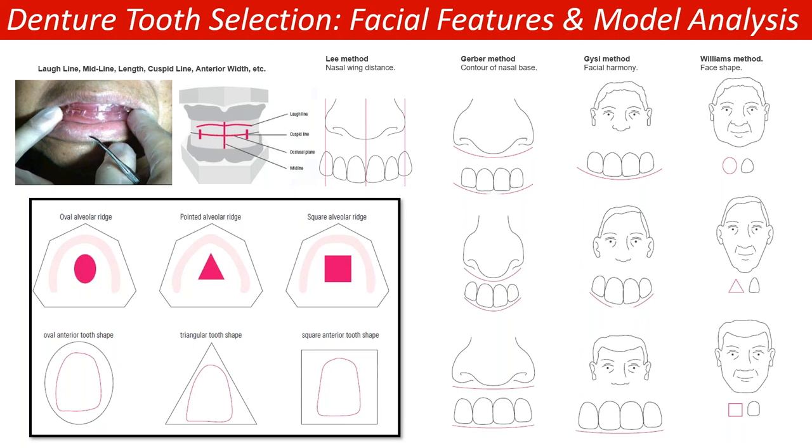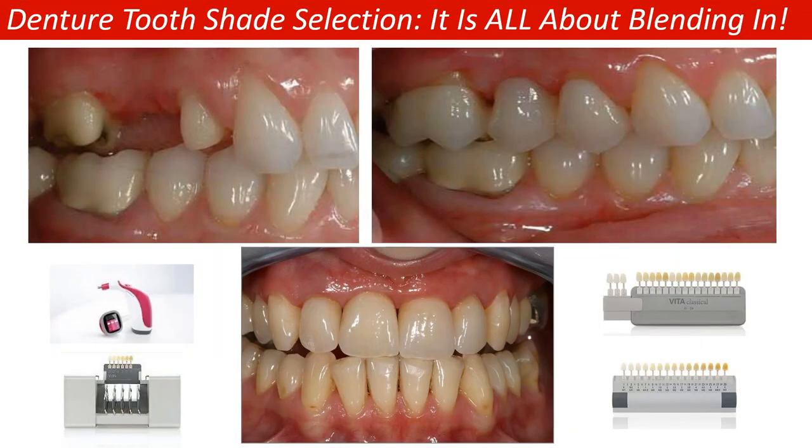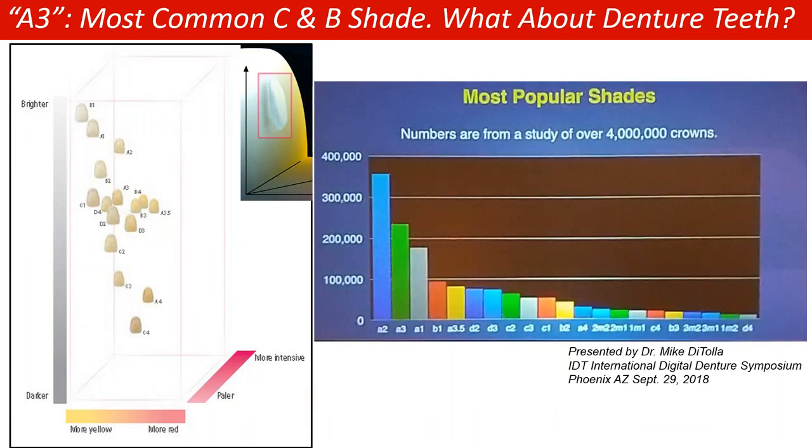But as far as full dentures, whether it's new ones, fixed ones, permanent or provisional dentures, we can start looking at the patient and deciding, again, the individual mold as well as the shade, and looking at the texture as well. How do they want to look? How do they want to feel? What kind of smile is that patient really looking forward to? Because again, just like crown and bridge, it's about blending in, creating dentures that fit that area.